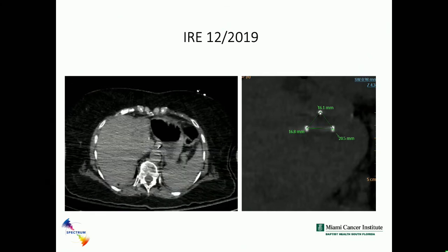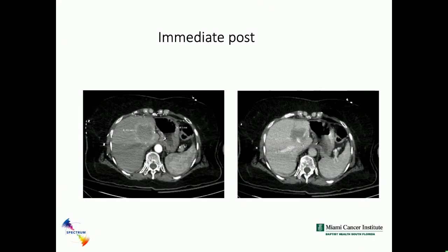Next slide, please. At any given time, you need 70 pulses to be delivered between 2 needles to complete a treatment.